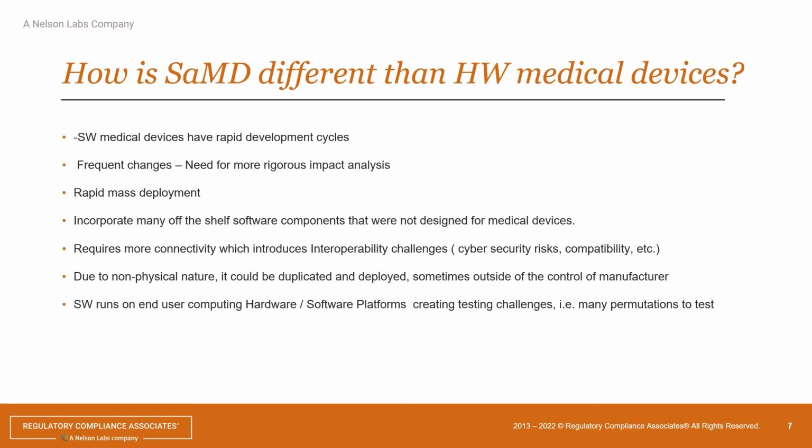And when you have software medical devices, the changes could be frequent, and hence you have to have more rigor involved, because not only that, but also you have the ability to mass deploy them, depending on what your deployment mechanism is. In the good old days when you had hardware, you had to go in and install it. That basically helped you get some feedback on how the device is running, compared to when you could push a lot of these out. It definitely presents its own problems, and hence the need for a quality system that is optimized for it.